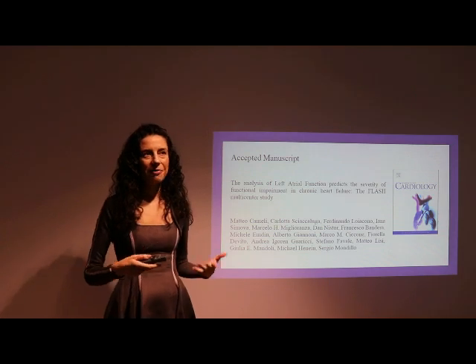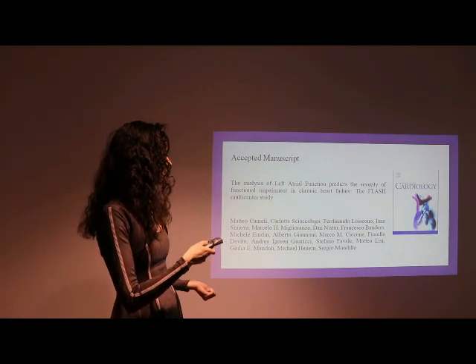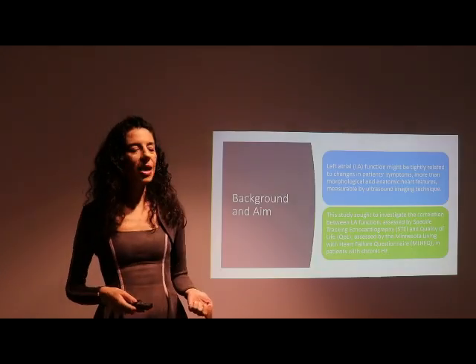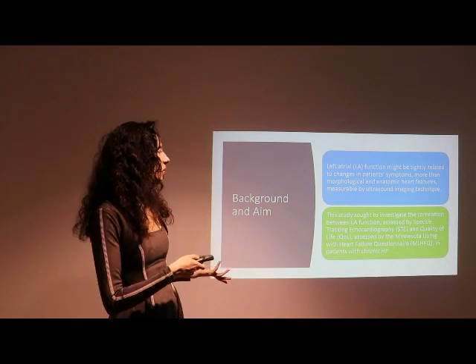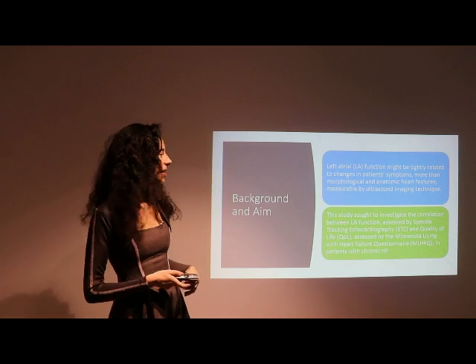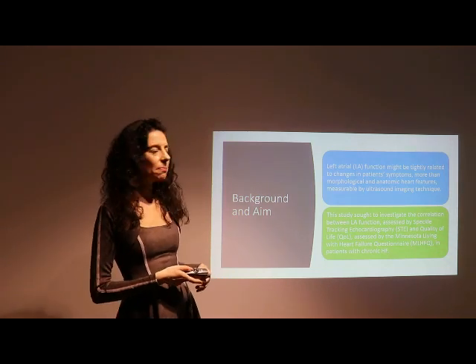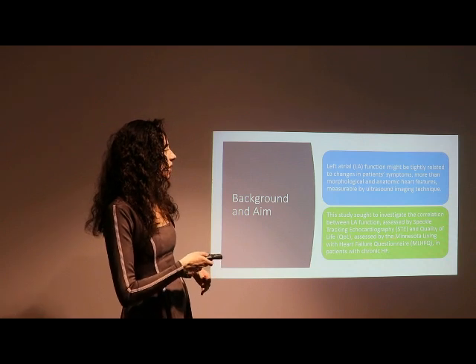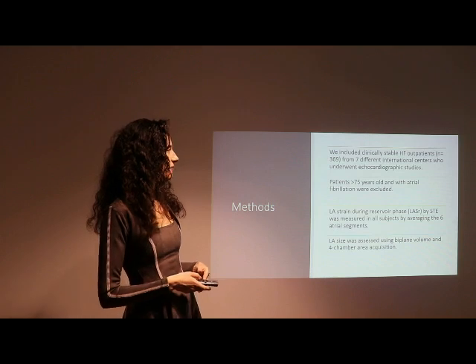It is a study of our collaborative group, the FLASH Multicenter study, and the aim of this study was to investigate the correlation between the left atrial function assessed by speckle tracking echo and the quality of life assessed by the Minnesota Living with Heart Failure questionnaire in patients with chronic heart failure.